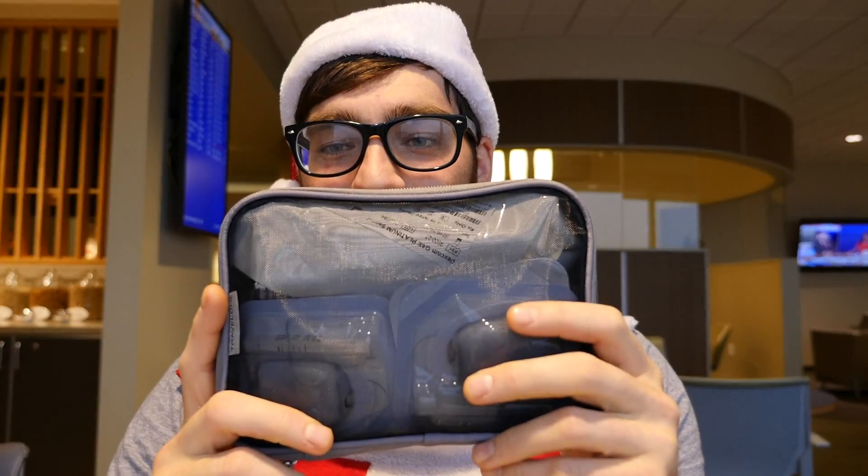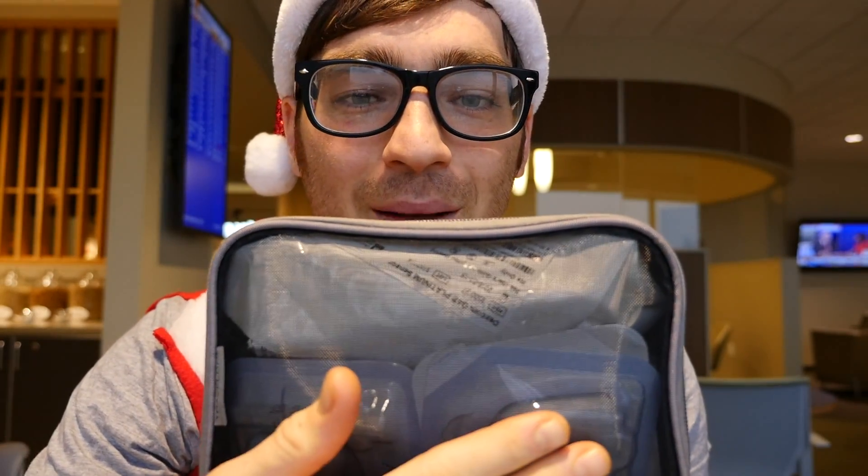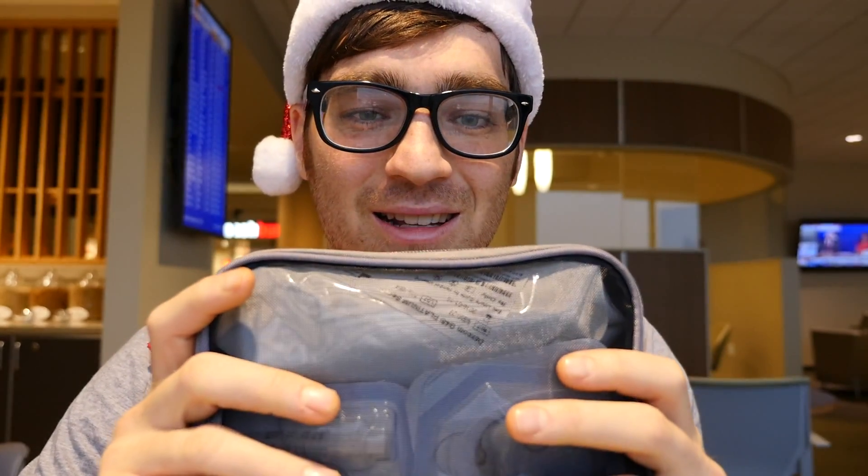To make everything concise and get it all packed down together, packing cubes are awesome. As you can see right here, I've got all my goods — my Omnipod, sensor, everything's in this one little bag. It's nice and neat. You can just throw it in your suitcase and you don't have to worry about anything flying all around. These are great for carrying supplies and not worrying about anything shuffling.